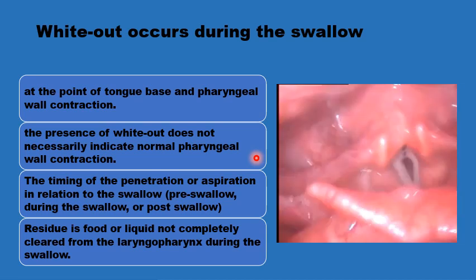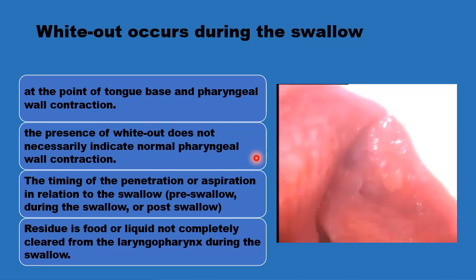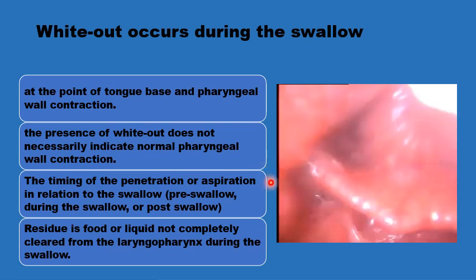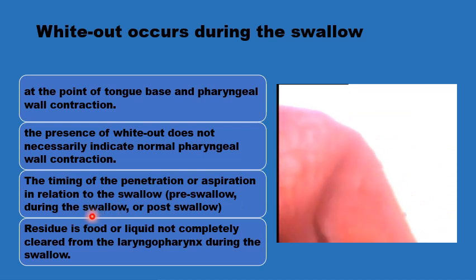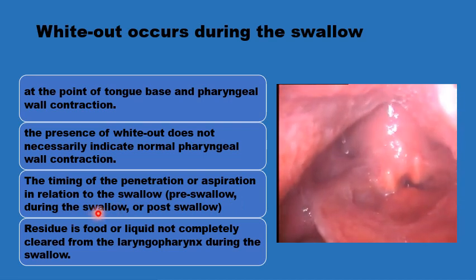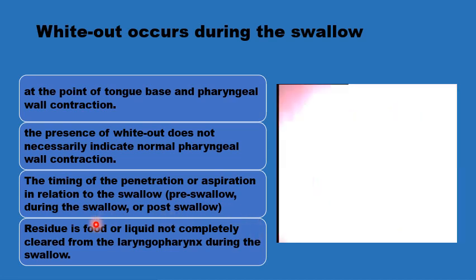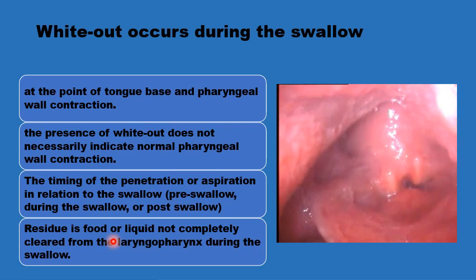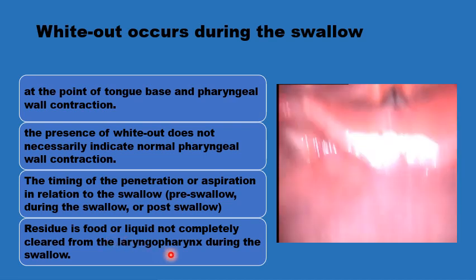The timing of any aspiration or laryngeal penetration in relation to the whiteout is also of clinical value. This is how we classify aspiration into pre-swallow, aspiration during the swallow, or post the swallow. And also any residual food or drink in the pharynx or in the vallecula after the whiteout should be noted.